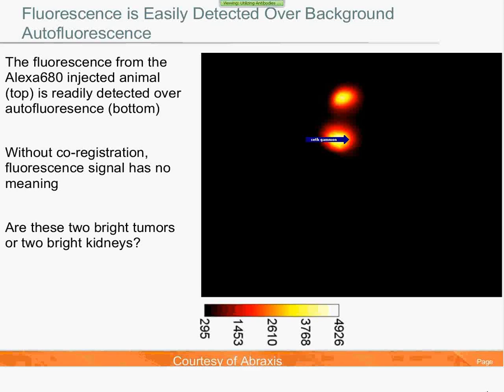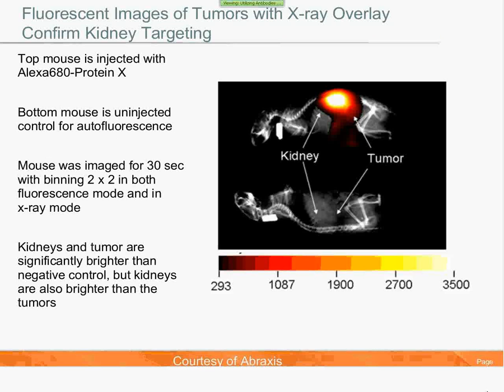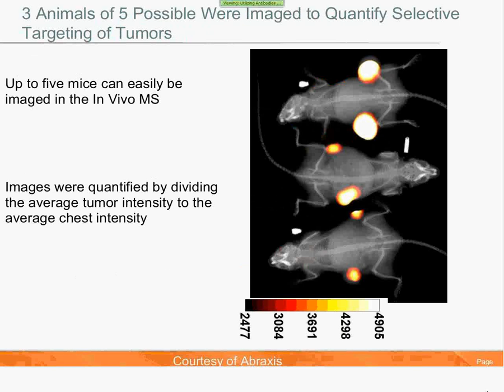However, when one looked at a different antibody conjugate, you can clearly see that there was very nice uptake and binding into the tumors that was specific. And again, the other nice thing about this protocol is that because of the long circulation and clearance of these antibodies, you're looking at 24 hours post-injection. And because of the very tight binding to the tumor target site, if you're off by 5 or 10 minutes and just looking at this image, you're not going to miss this tumor binding.